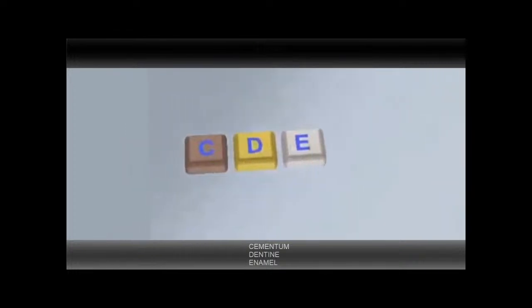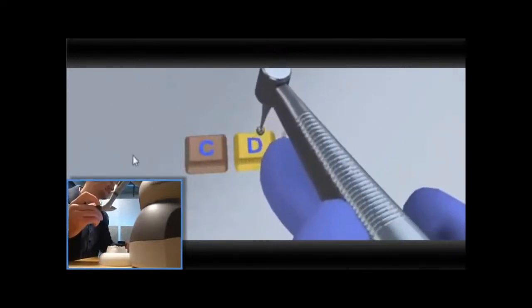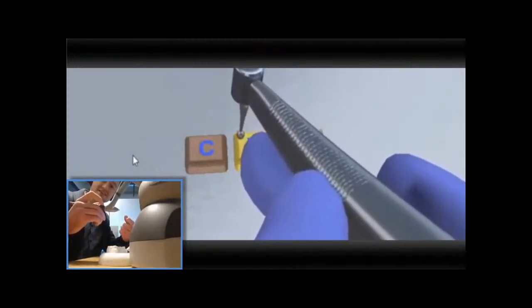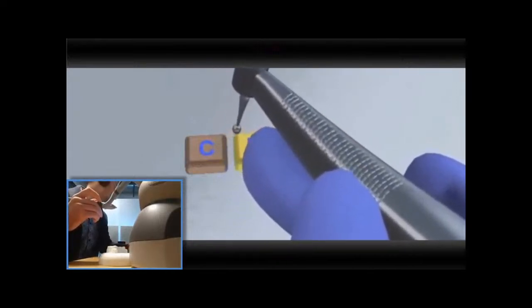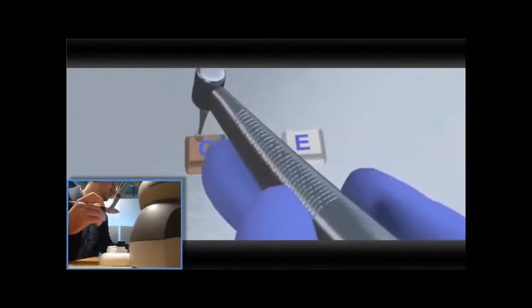So you have C, D, and E. In this exercise, dentists are learning how to use the haptic by tracing the letters on the key with the virtual drill while drilling down into the different material properties of the human tooth. This is critical to understand because plastic mannequins do not have the internal anatomy that's found within humans. And through VR coupled with haptics, dentists are exposed to these differences very early on in their education.